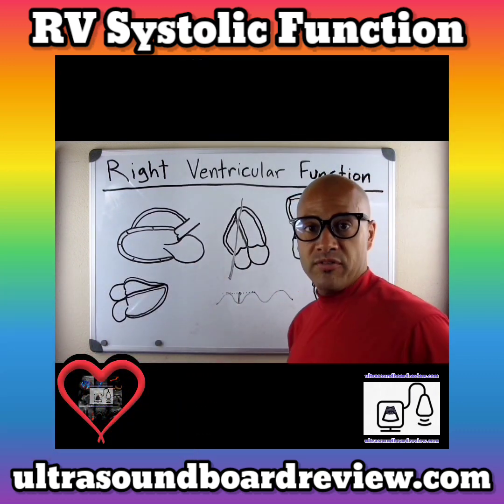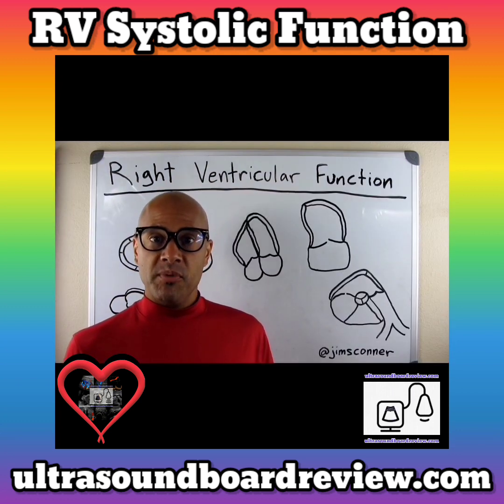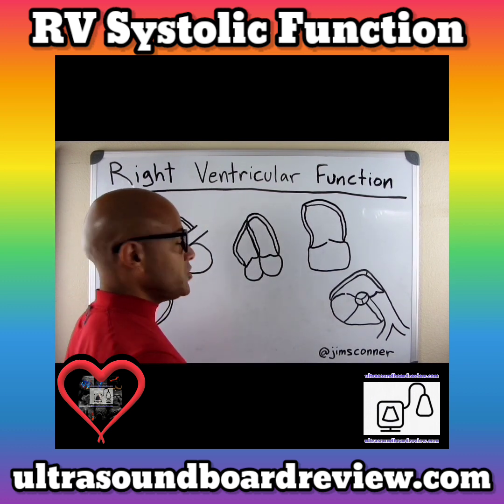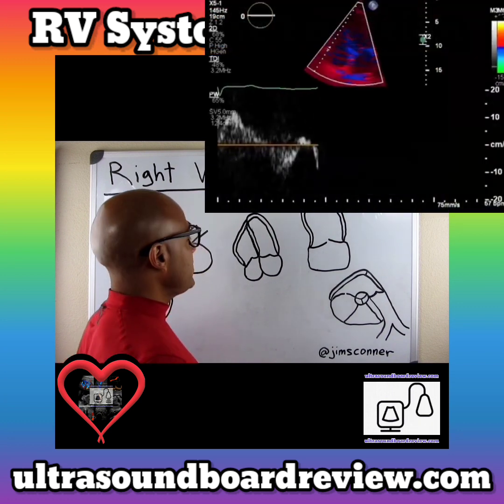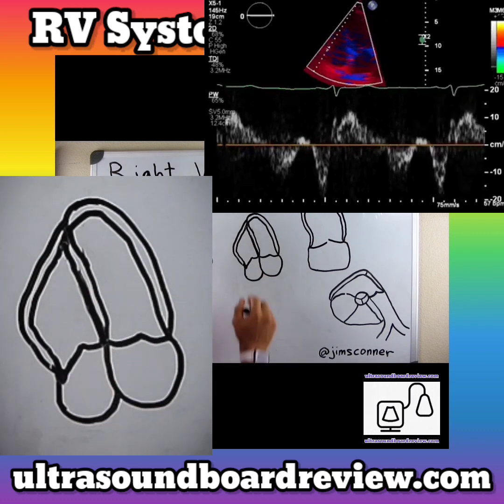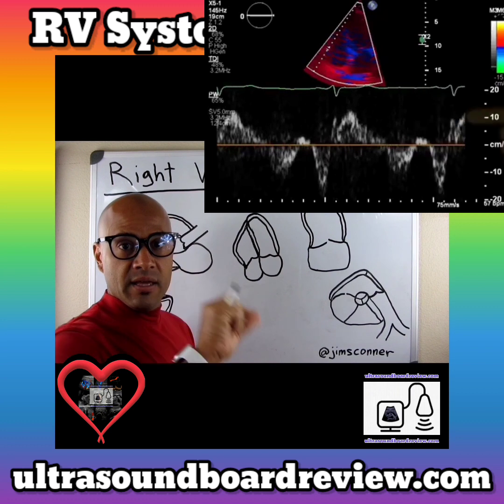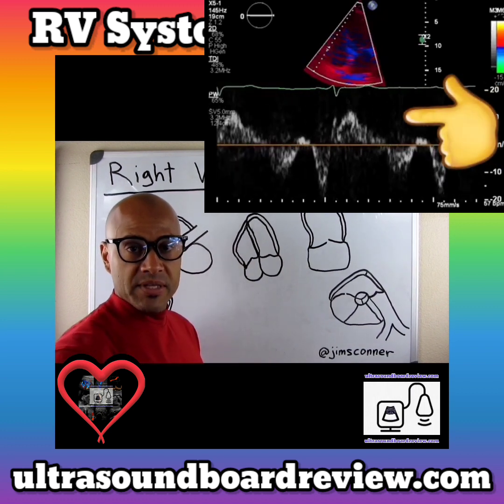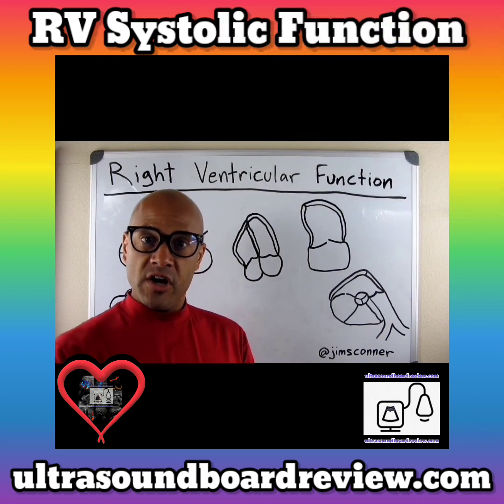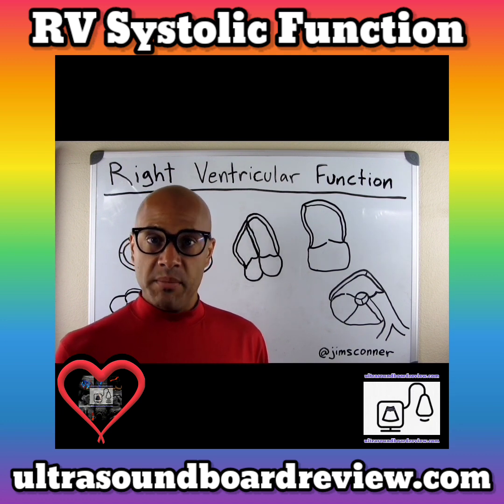Using TDI pulse wave is another simple way to determine RV systolic function. Once you turn on TDI, you will place your pulse wave right on the lateral annulus of the tricuspid valve. You're going to get a waveform, and you're going to measure the waveform above the baseline — this is the S prime. This will tell you the velocity of the longitudinal systolic function. Normal values for the S prime is anything above 9.5 centimeters per second.